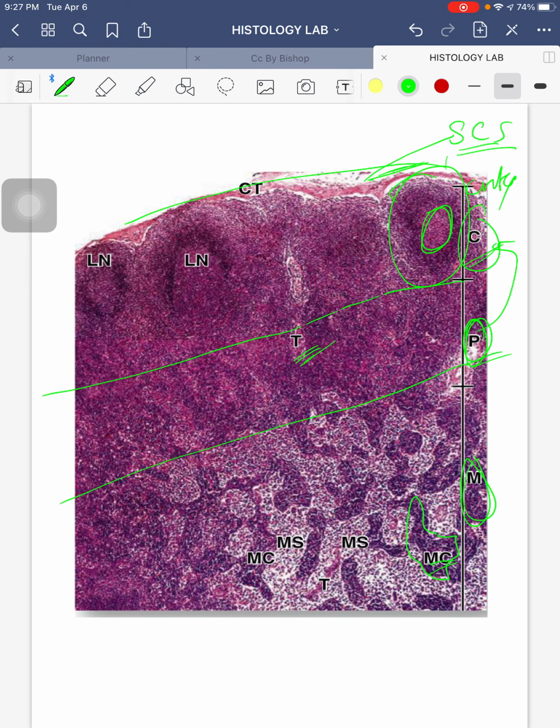The sinuses, so if you're talking about medullary sinus, these are dilated spaces. So again, the word sinus, immediately let space come into your mind. These are dilated spaces lined by discontinuous endothelium that separates the medullary cords. White area, if that's what's pointed at, if you identify the structure pointed at, medullary sinus.